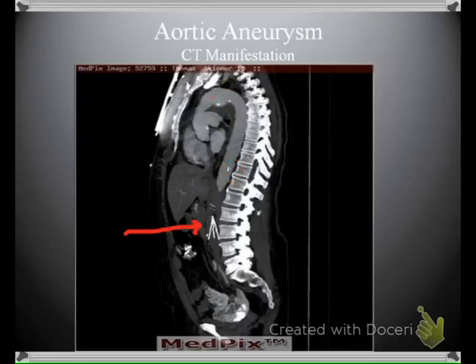But another thing that will give us the age of the patient is we have some calcifications here on the spine, and based on this, it could be subjective to the imaging technique, or it could just be due to osteoporosis. But we do see that the vertebral bodies do have a loss of calcium there, and so potentially that this is an older patient.